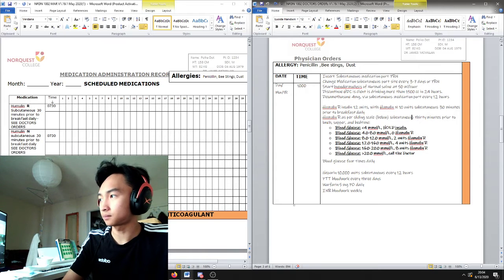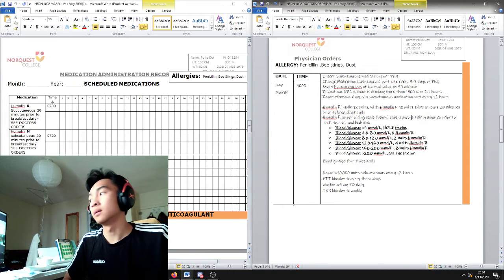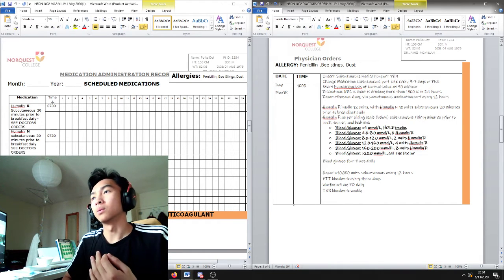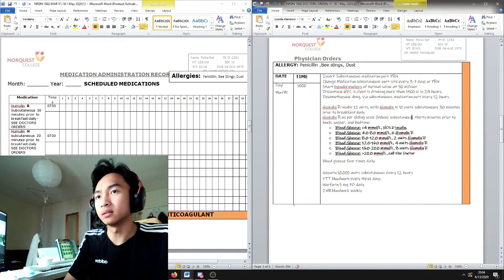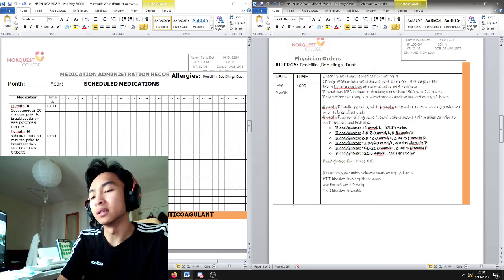And I'm going to the patient's bedside, readjusting the height of the bed, putting the guardrails down, and then I would perform hand hygiene again, wear gloves, and then I would inform the patient of their 5 rights, such as their right reason, to help them with their diabetes and regulate their insulin, their right to refuse if they have taken this medication earlier today, maybe, or they just refuse for some reason.